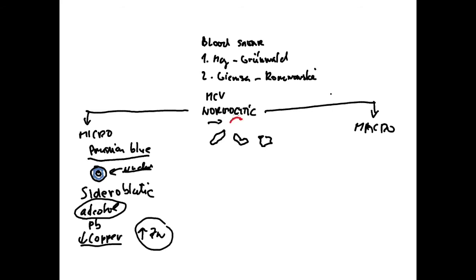So basically, this would be a normal erythrocyte, and over here you see schistocytes. They're broken like this. This is typical with MAHA, as we talked about it. So remember MAHA, microangiopathic hemolytic anemia, and again I will stress especially DIC, TTP-HUS, and HELLP syndrome.